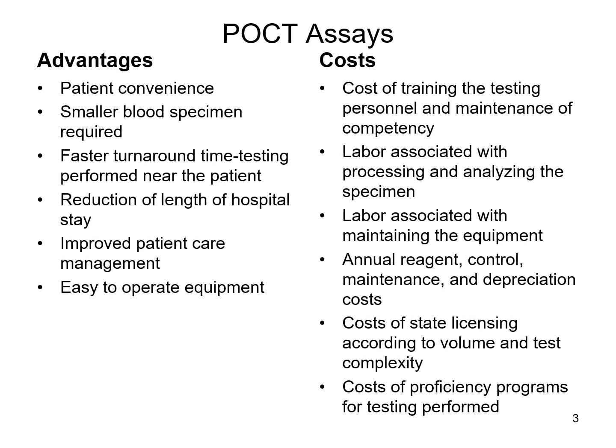And of course, also there's cost associated with getting the licensure to actually perform the testing in your laboratory, your physician's office practice, or wherever you may be setting up any sort of point of care testing. And so there are costs associated with that licensure. And you are billed based on the amount of tests that you perform and the complexity of those tests. And so also part of the regulations does state that you have to have some sort of proficiency testing program. And so you do have a cost of those proficiency testing programs.